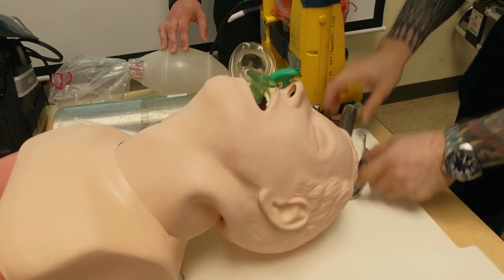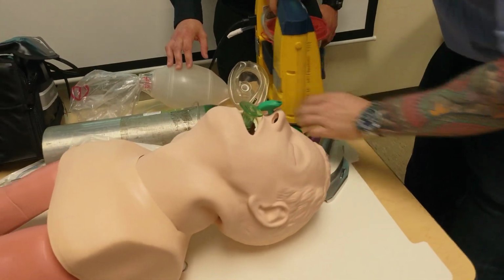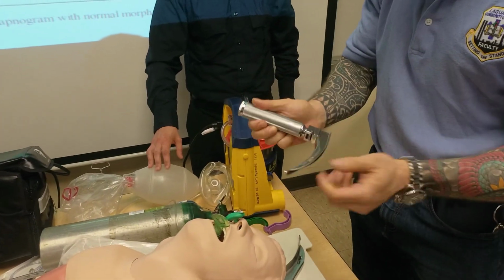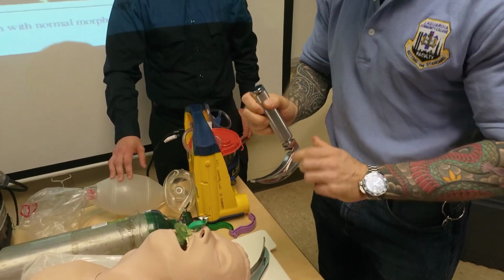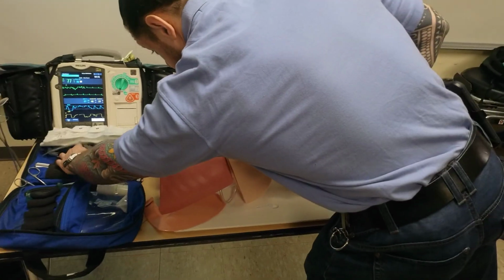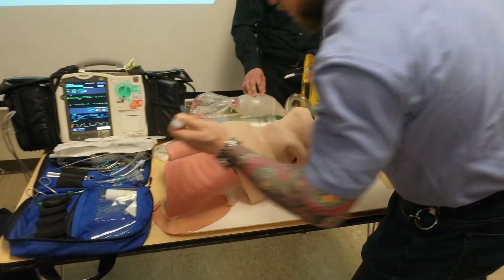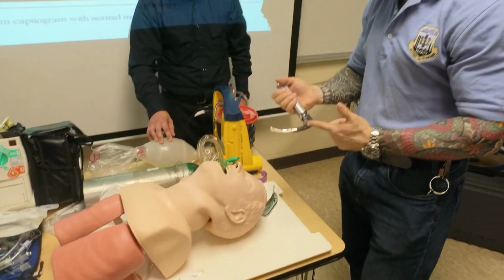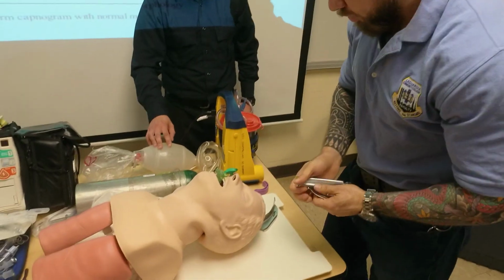Stay here, I'm going to use you as my partner. You're then going to prepare all your equipment. You're going to get your blade. I'm using here a Mac blade. You have a Miller, which is a straight blade. There's no such thing as one blade for trauma or medical. You use the blade you're most proficient in. I'm most proficient in Mac, so I'm using that. So check your blade.